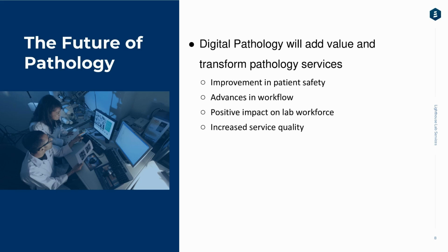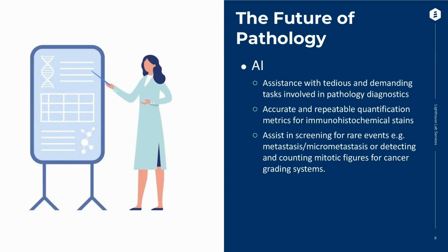And last but not least, digital pathology will increase service quality for the patients, offering them faster access to their results. And additionally, improved information sharing and collaboration will hopefully lead to enhanced diagnostic confidence with a higher quality of diagnosis.